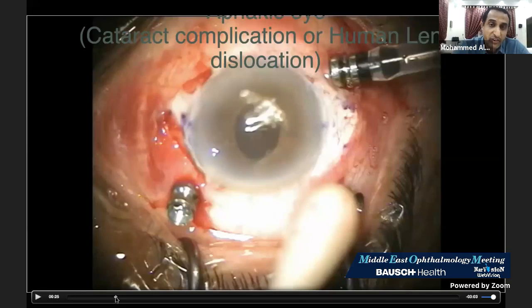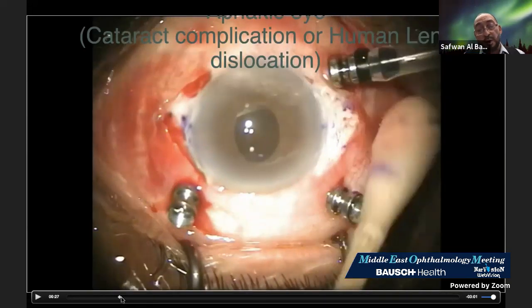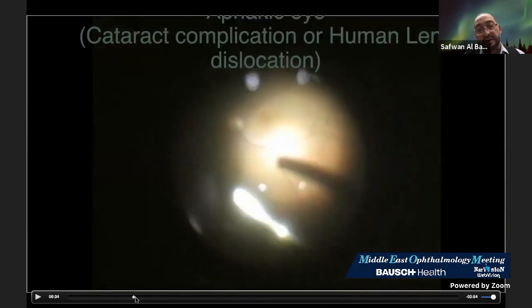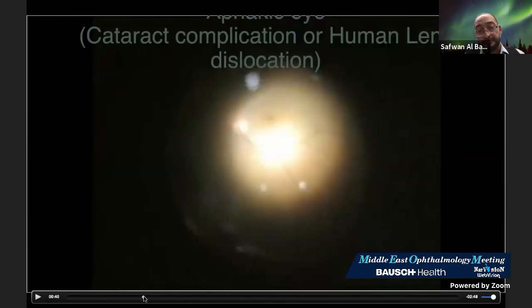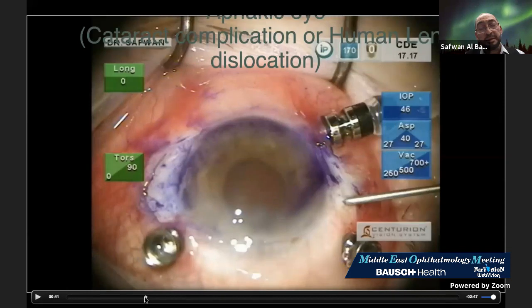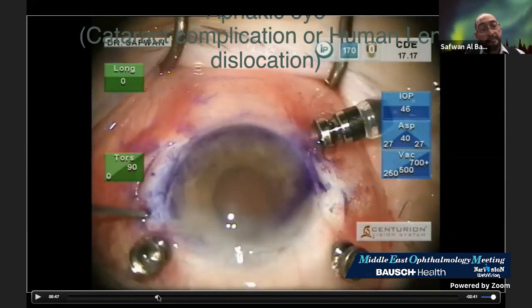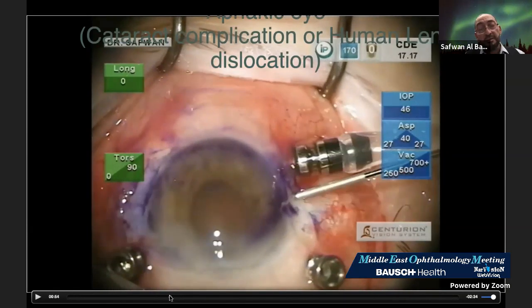Okay, so I will continue step by step. Here, when I prepared everything, I went to finish my duty inside the eye, where I removed all the lens material and returned back. Now, in this step, I will go to the MVR and open the sclerotomy sites here. For each one, I make sure that I'm tip in, and then I will test my gauge 23 forceps.